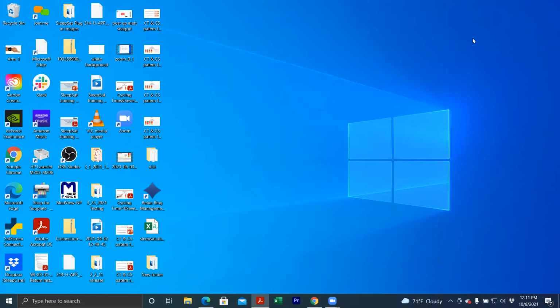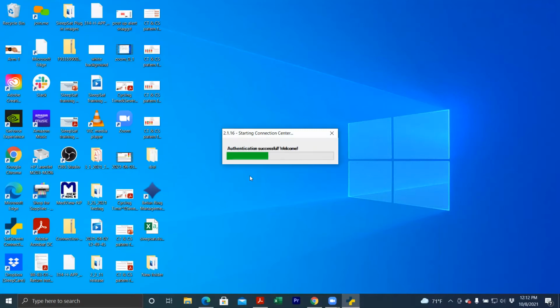Now I'm actually going to start with the SleepSat in hand, and I'm going to hold down the power button on the unit until the display lights up and it says probe off, as it says right there. Once it says probe off, I'm then going to plug the micro USB cable connected to my computer already into the SleepSat body. You just heard that connect. Once you hear that connection noise, go ahead and just open up the SAT Screen Connection Center.